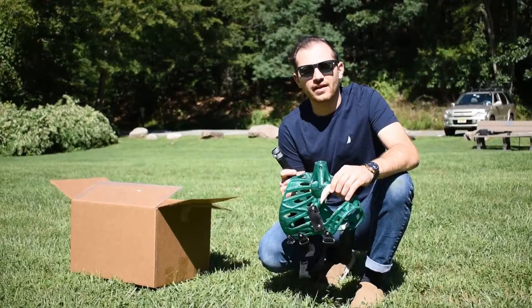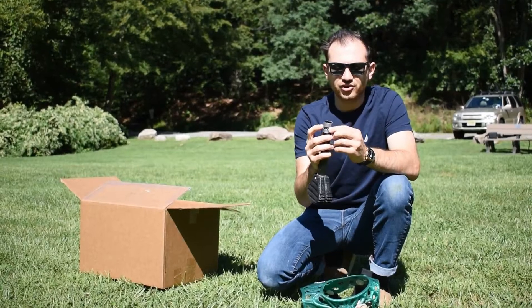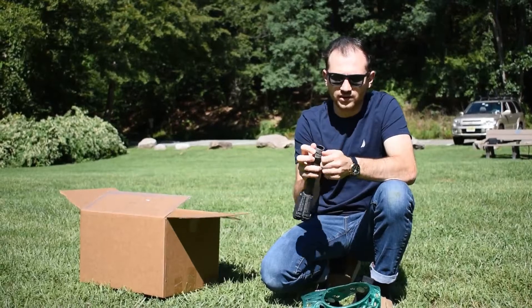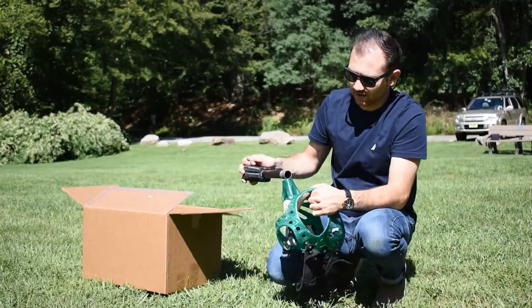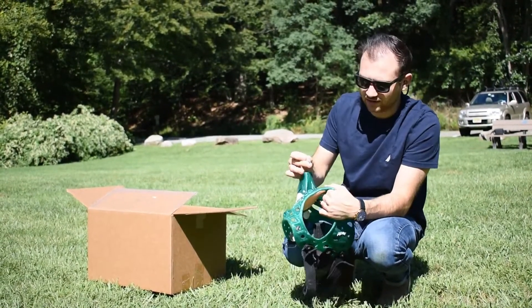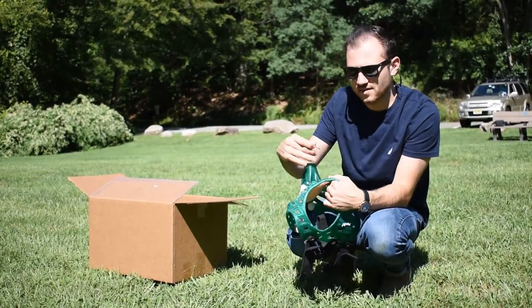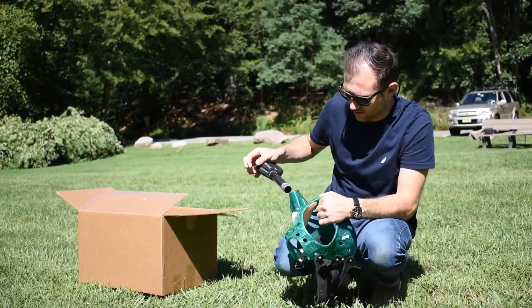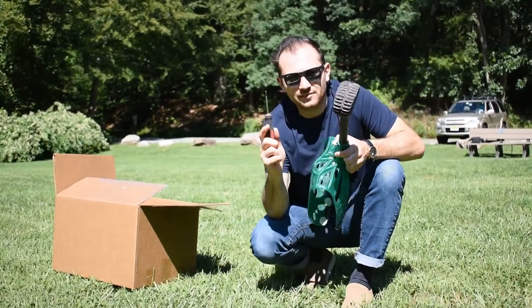Your leg will come with a bolt through it, along with a washer and a nut. Make sure you keep hold of that washer — you don't want to lose it. We're going to loosen this off the bolt and push the bolt out of the leg. When you put this on, most times the bolt will be facing the inside of the dog's leg. You want the head of the bolt facing towards their good leg — you don't want the nut on that side, because sometimes the bolt sticks through and you don't want the leg to catch on that.